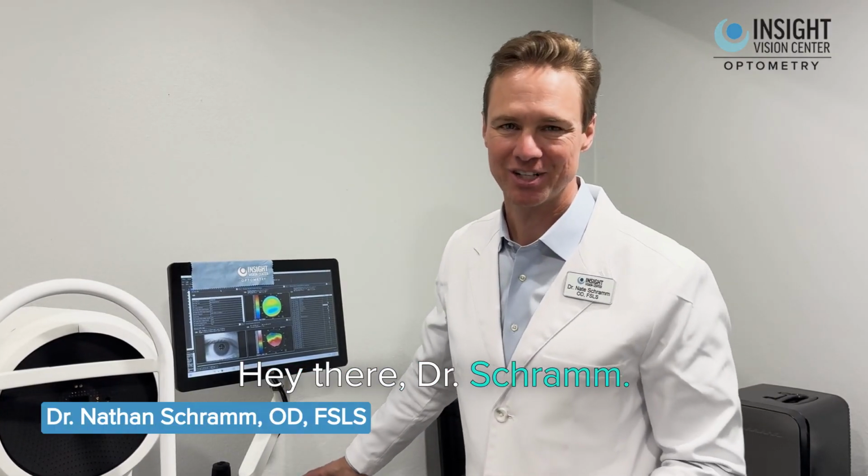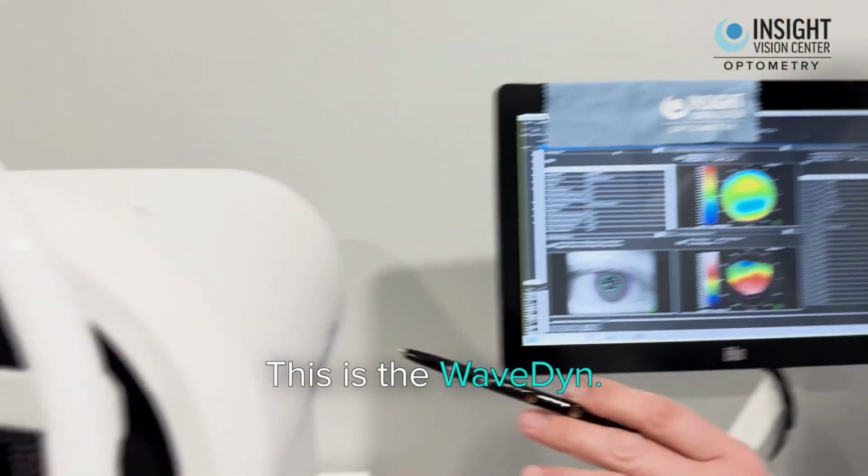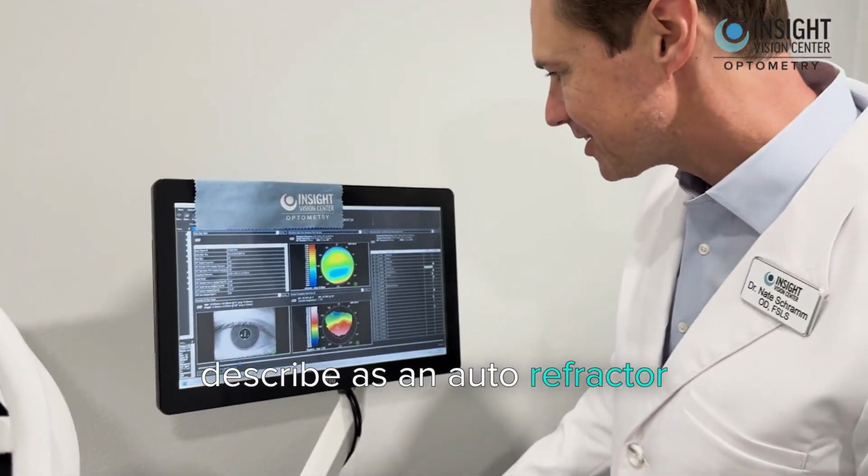Hey there, Dr. Schramm. I want to show you something neat. Come on in here. This is the WaveDyn, and the WaveDyn is what I describe as an autorefractor on steroids.